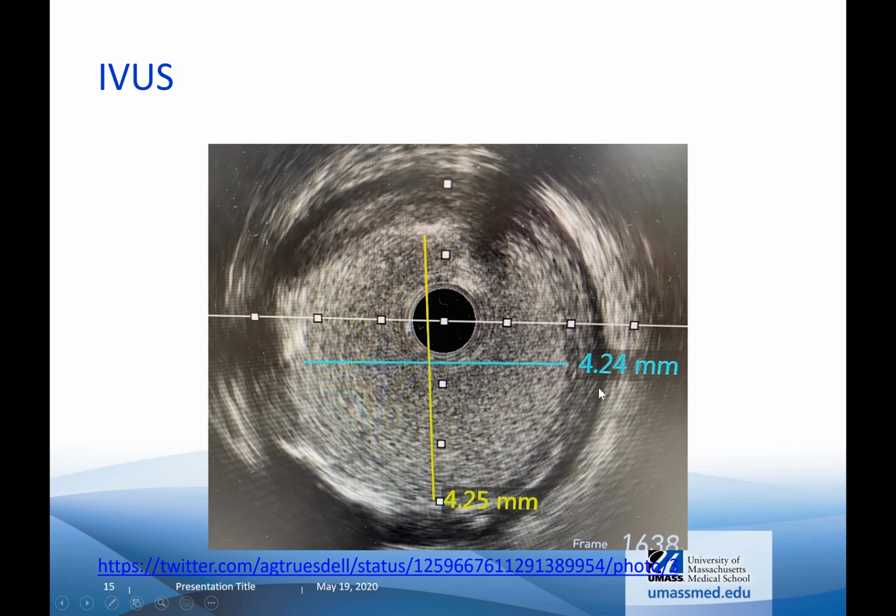So we measure all the stents, or the sizing of the stents, either by this EEL diameter or inside the endothelium. So you see they're measuring the stent size by inside of the endothelium. I like to use something in the middle of that, somewhere between the EEL and the endothelium, which I call midwall sizing.